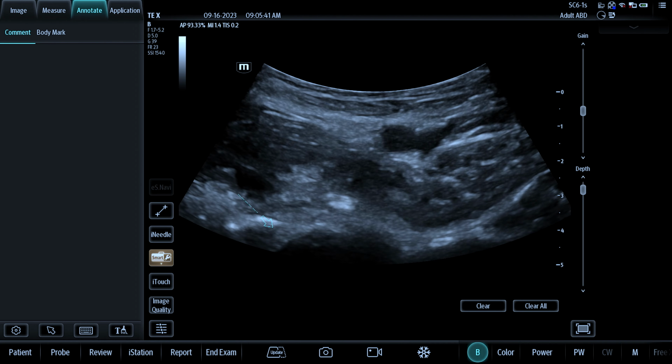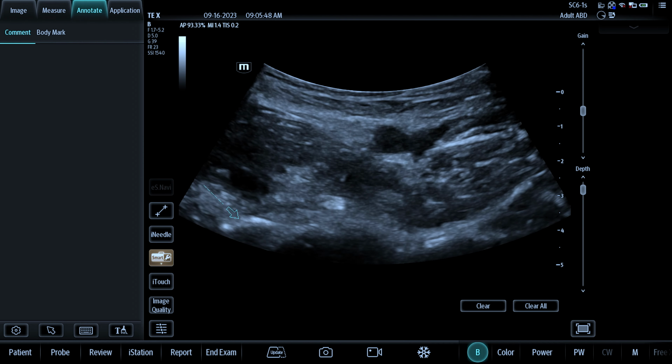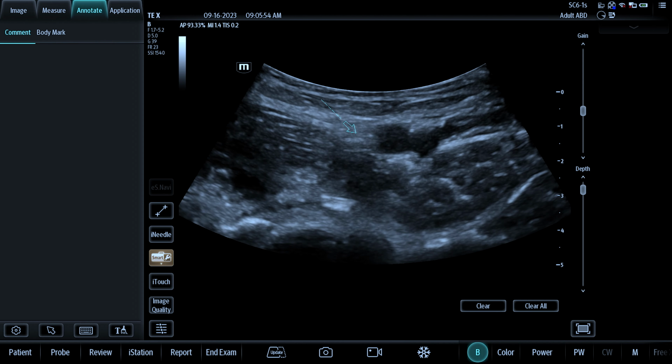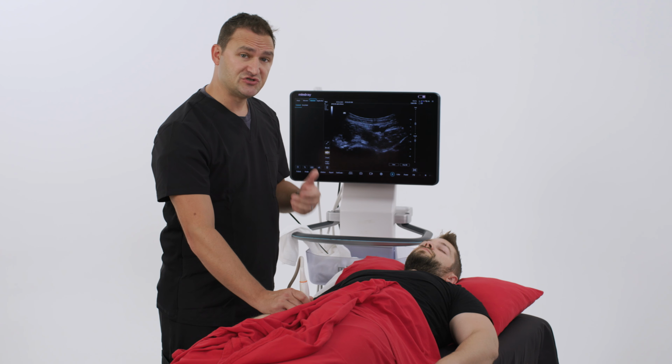This is very important because if you're above the fascia covering the iliacus muscle, that local anesthetic can spread around the iliacus muscle and get your femoral nerve, thereby causing quad weakness, which is what we're trying to avoid to begin with by doing a PENG block. It should be a very difficult block to inject.